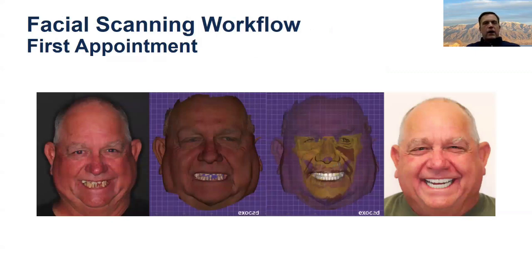The last workflow I want to talk about is facial scanning. If you think about all the things that you send to the laboratory beyond the master impression, most of the time they're an approximation of the patient's face. And here's what I mean. We've talked a lot about bite blocks. If you think about it, what a bite block does is show a thing that properly supports the patient's face and sits correctly within the patient's face. So if your laboratory puts the teeth within that envelope, they'll work for the patient. But it's not the same as seeing it in the patient's face.